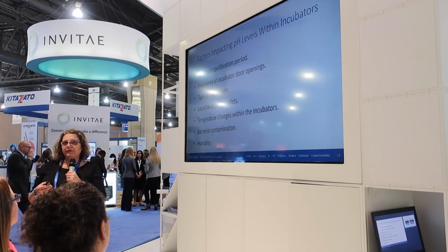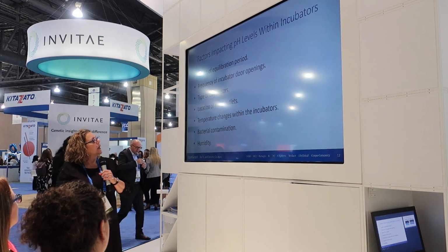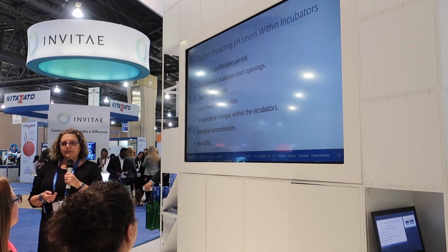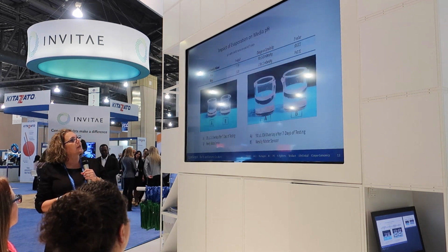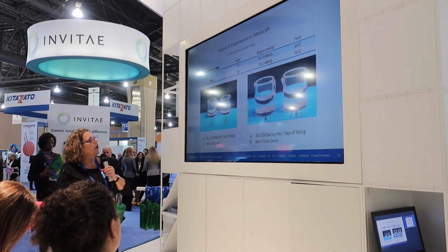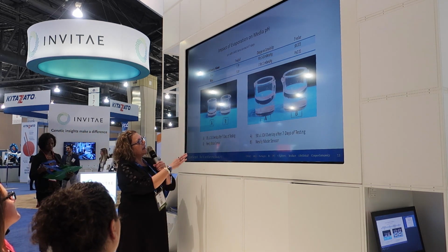Is it right on top of the incubator? That will make a change. Temperature changes within the incubator and humidity. So those are other factors that you want to keep in touch with. This is just a graphic representation. You could see it in the first slide here.